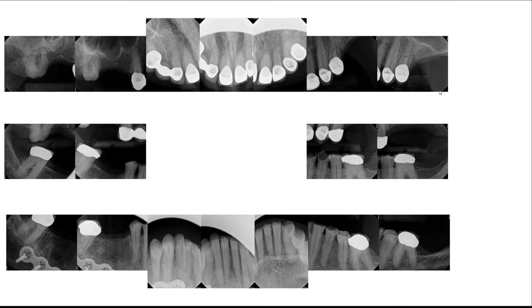Another area I want you to pay close attention to is the severity of attrition visualized in the anterior mandible. Teeth have lost a significant portion of their crown. What I've been told by the student is that this was not present at the time of the injury, but only after these crowns were placed — now the patient has literally ground away the crowns of the mandibular teeth.